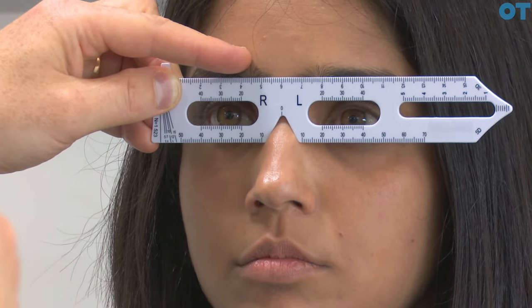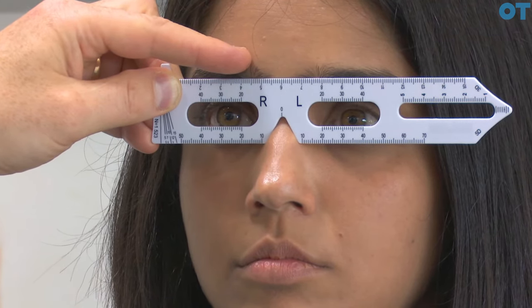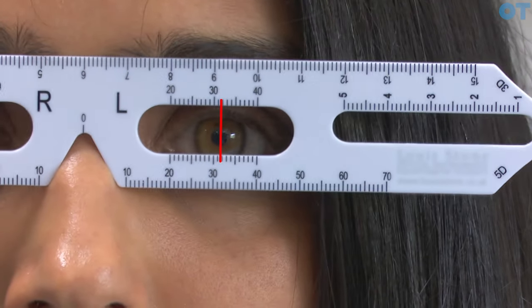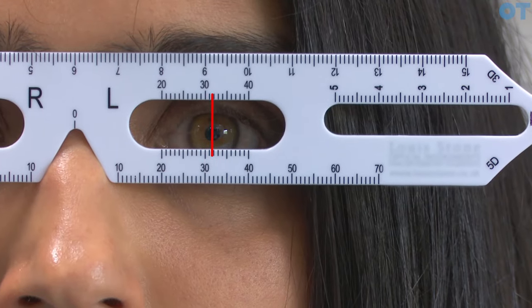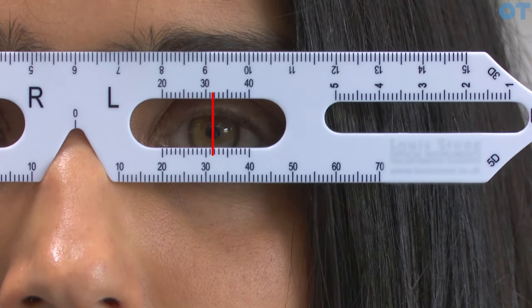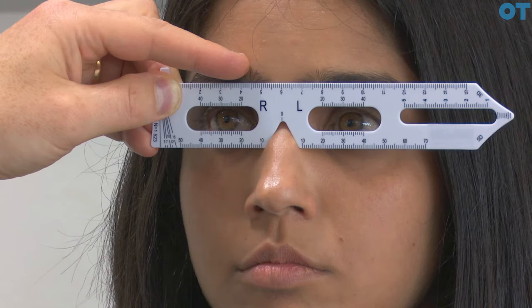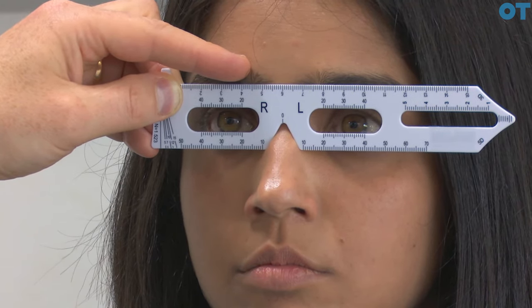Next we swap over to the left eye and get the patient to look directly into our right eye. Again we're measuring the distance from the center of the nose, denoted by the zero on the ruler, over to the center of the patient's left pupil. Here we see a left pupillary distance of 31.5. We then double-check the measurement of the right eye and the left eye.